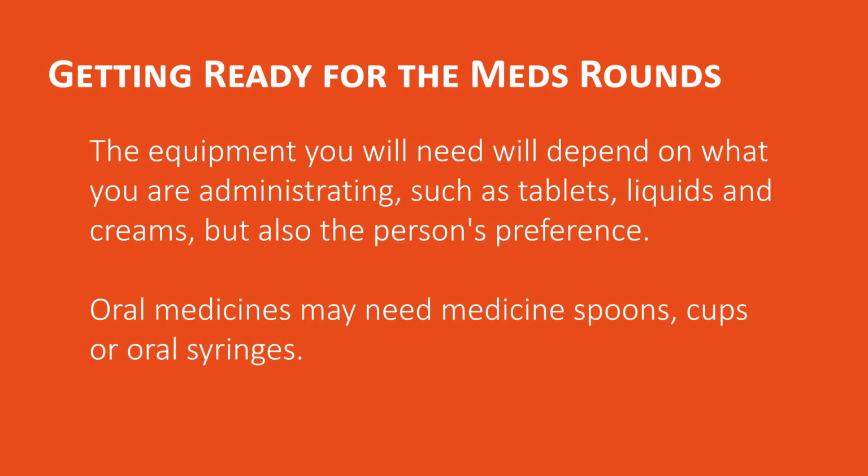Getting ready for the meds round. The equipment you'll need will depend on what you are administering, such as tablets, liquids, creams, but also the person's preference. Oral medicines may need medicine spoons, cups, or oral syringes.